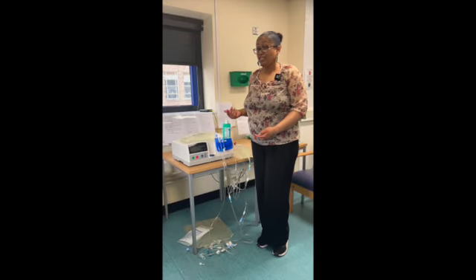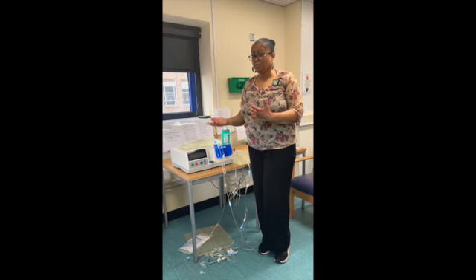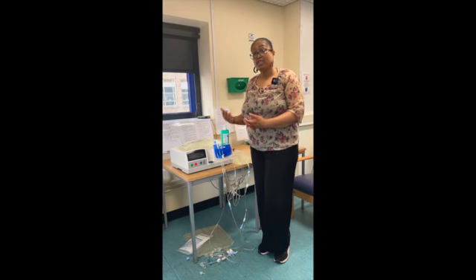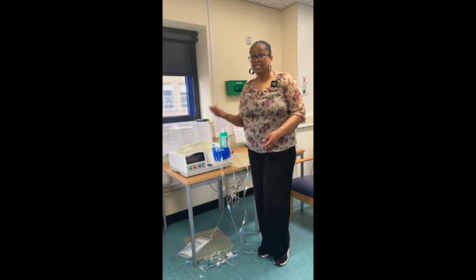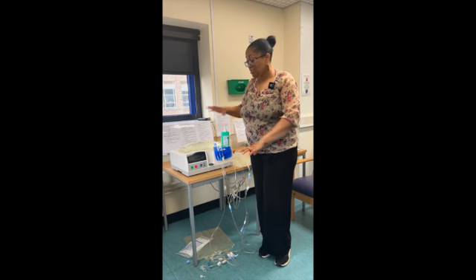The machine is now ready for me to connect to, and the beauty of this is I can do this process in the morning, ready to connect at night or later in the afternoon. It gives me the flexibility to set the machine up ready for when it's needed.